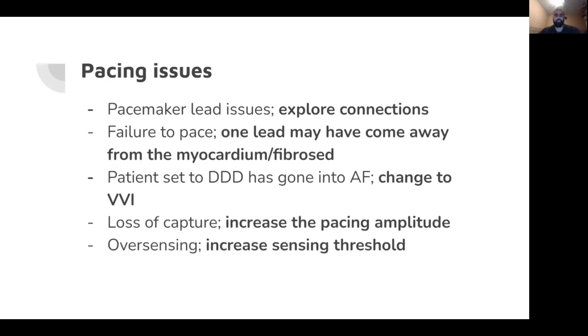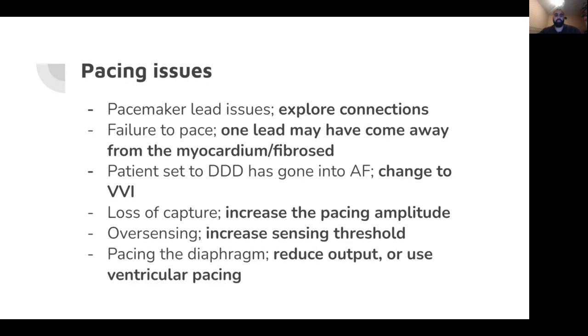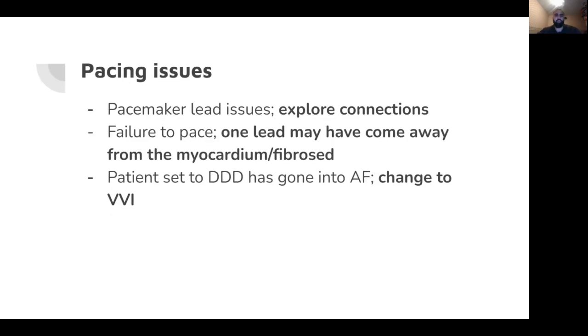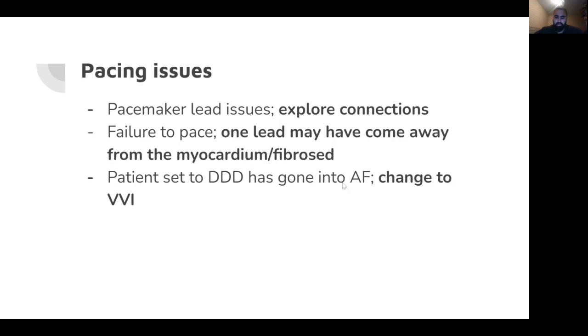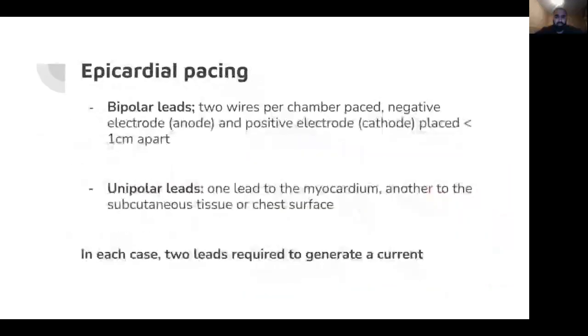And then you may get loss of capture, oversensing, or in theory pacing the diaphragm, but this doesn't really happen. One thing I want to focus on is this loss of capture. To understand loss of capture, firstly, we need to understand capture. I thought I had a slide on that, but I'm not sure if this may have gone.